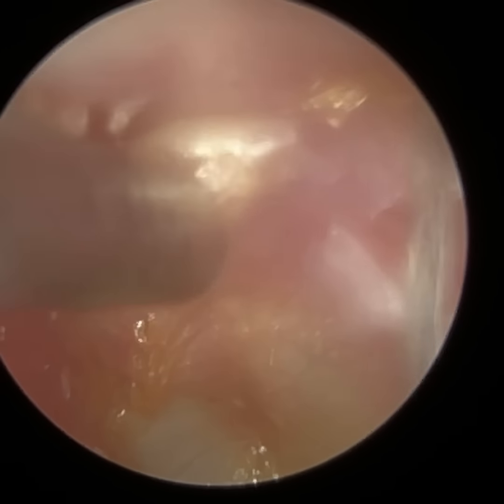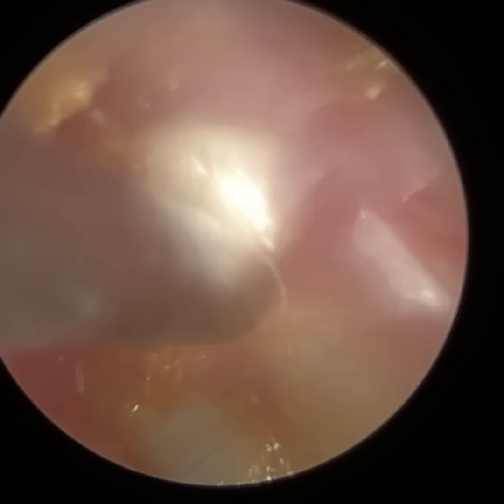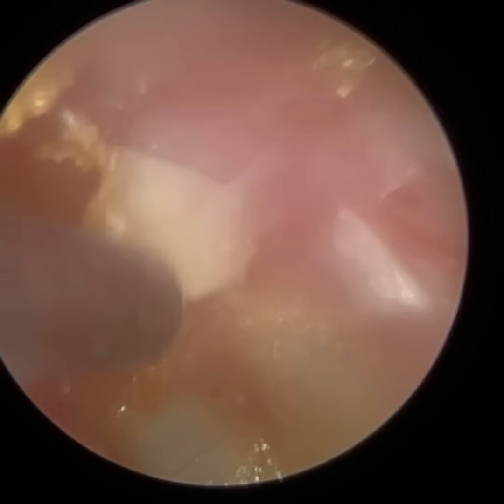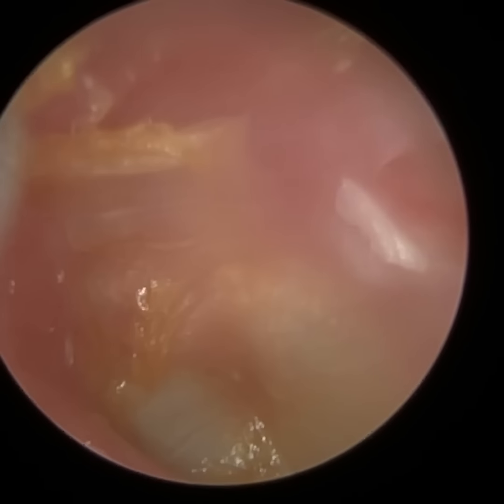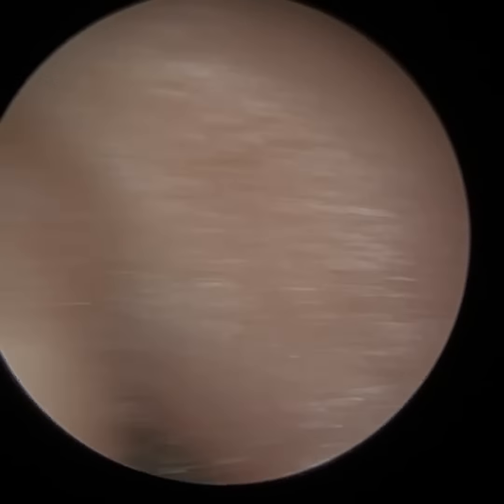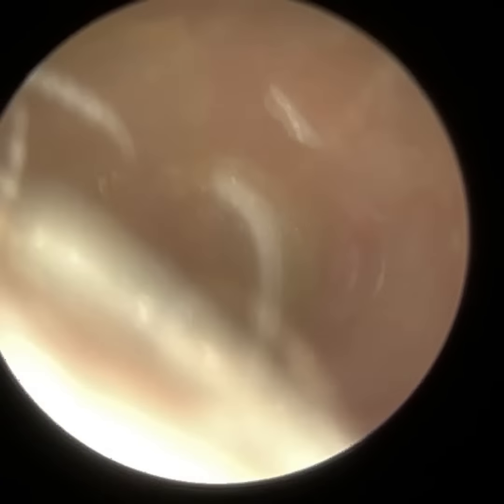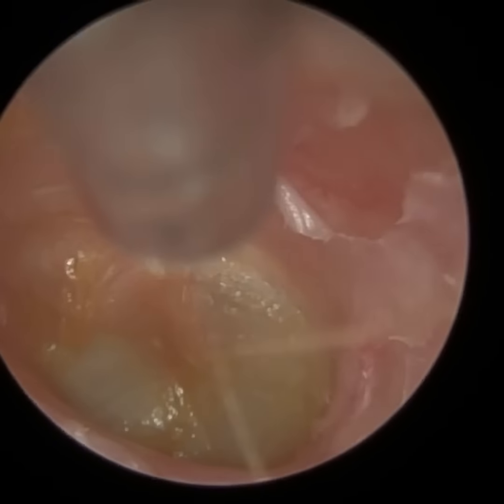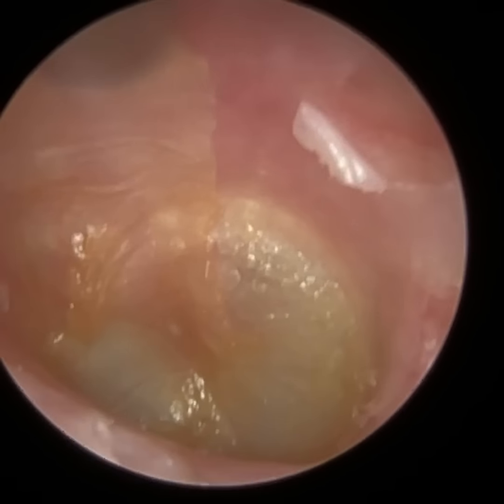So we're just peeling some skin here from the posterior superior aspect of the ear canal. So we're slowly approaching the eardrum. So here, because we're working at the roof of the ear canal, I got off my ENT chair and I was almost on my knees looking up into the patient's ear to gain access. The patient had a bit of a stiff neck, so they weren't able to tilt their head.